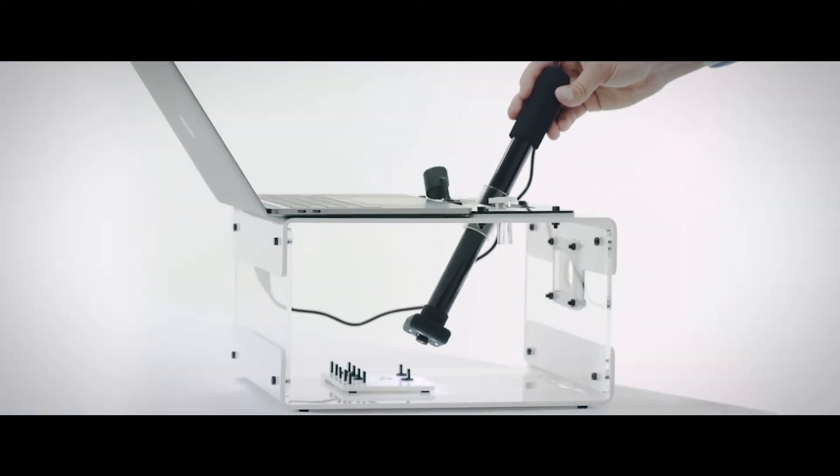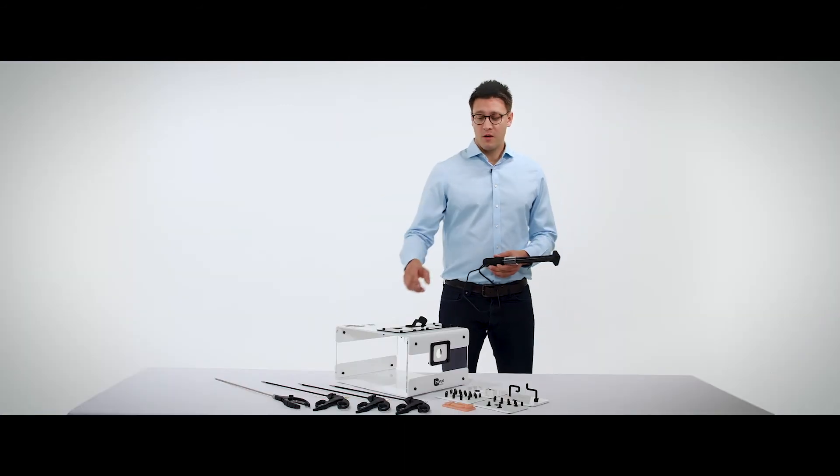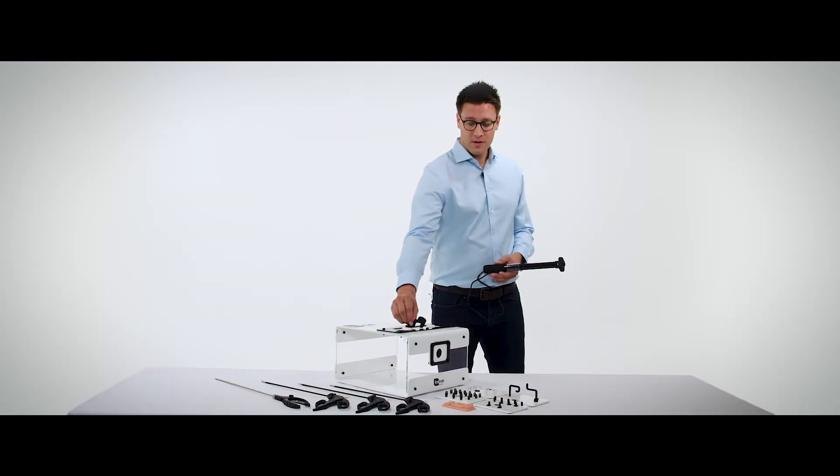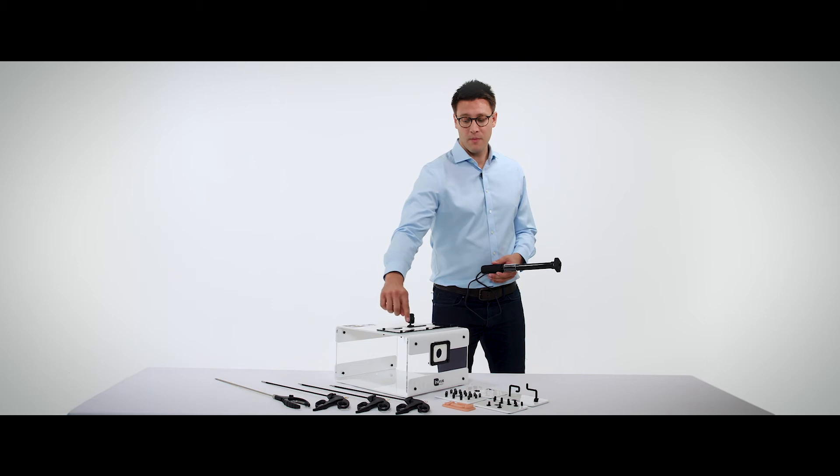The scope can be placed inside the simulator and used both during single operating or dual operating. During single operating, we're able to fix the scope still with this bracket, which can be swivelled out of the way during two-person training or simply unscrewed and removed.